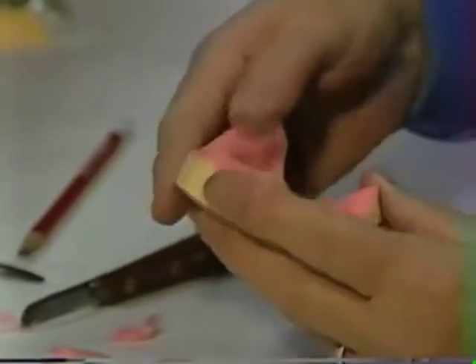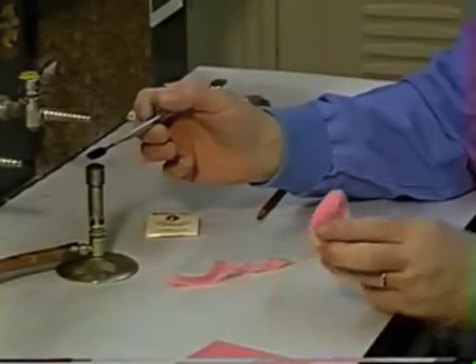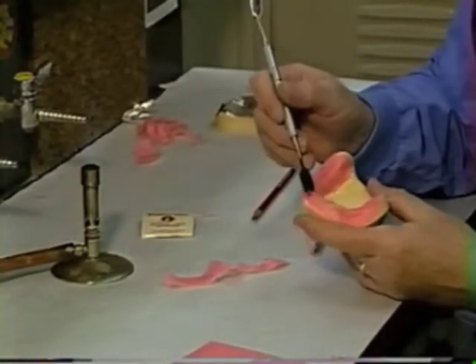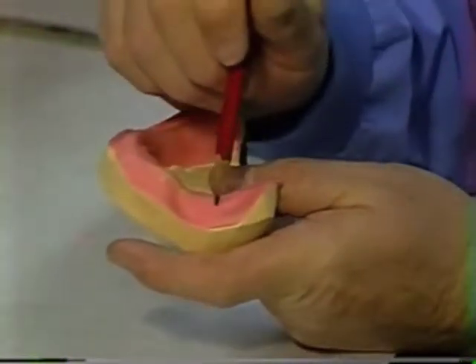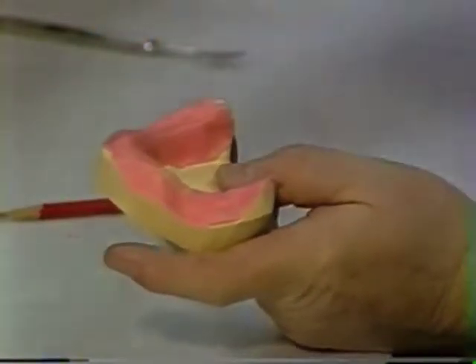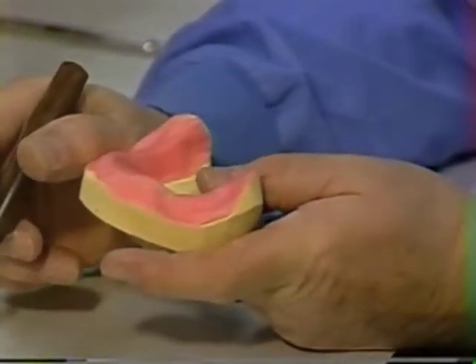Now once we have the wax adapted like this, if you need to, you can take a warm spatula and smooth out any seams of the wax. If we're going to leave a stop in this tray, we will want that stop to be directly over the buccal shelf. If you cut your stop into the wax and build it into your tray as you go, make sure that you cut enough of that off to provide a good wide stop.